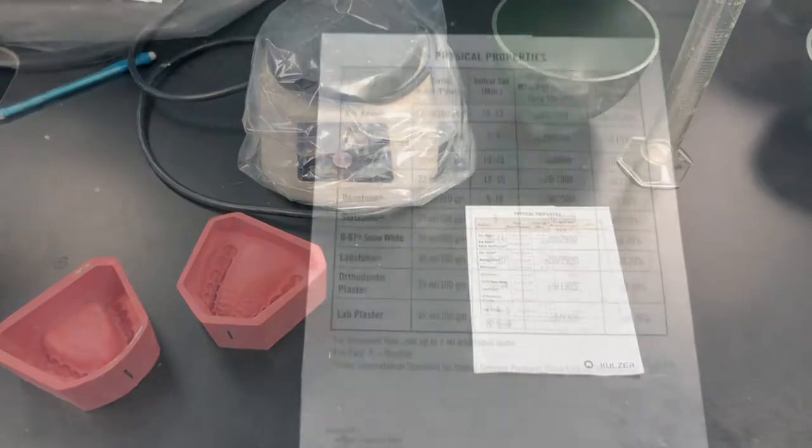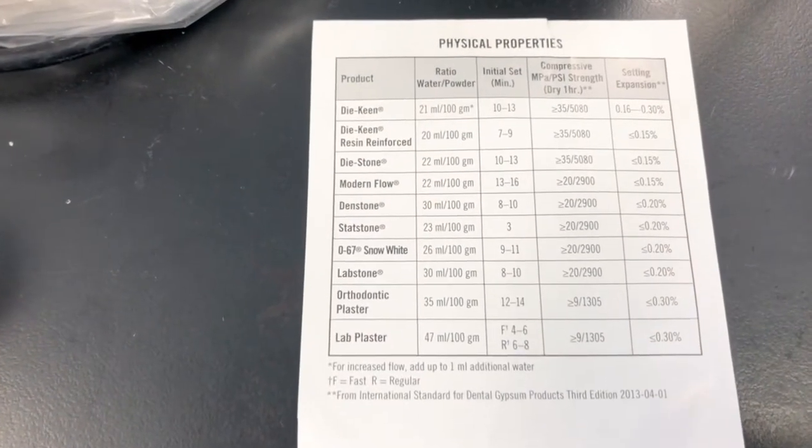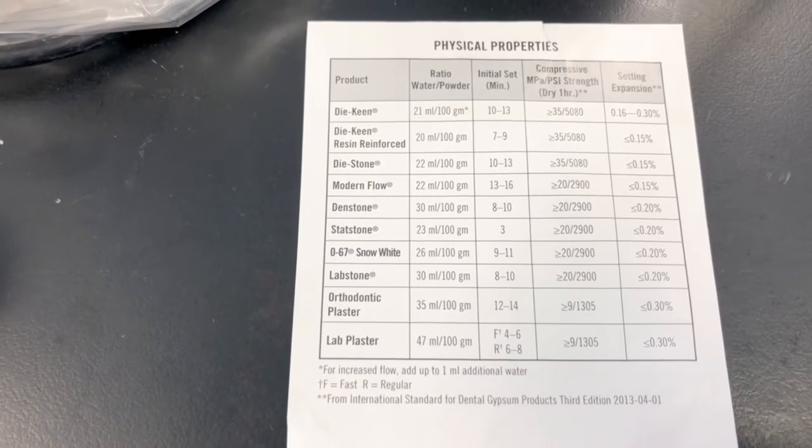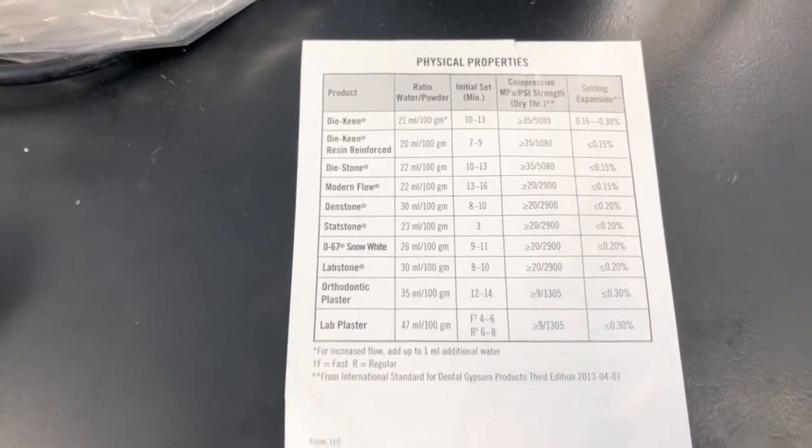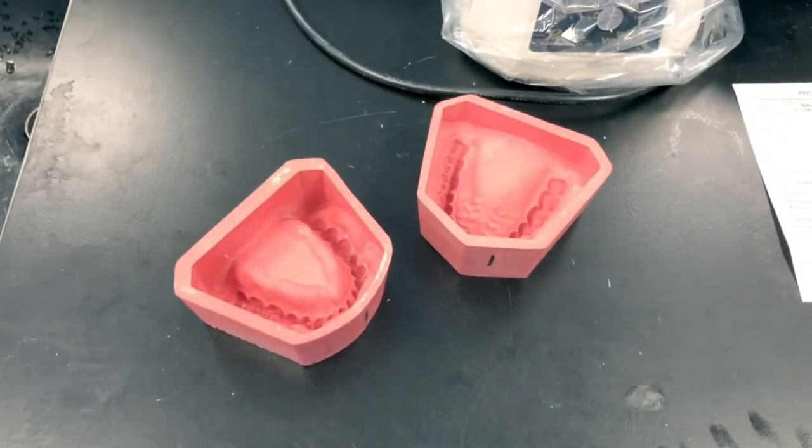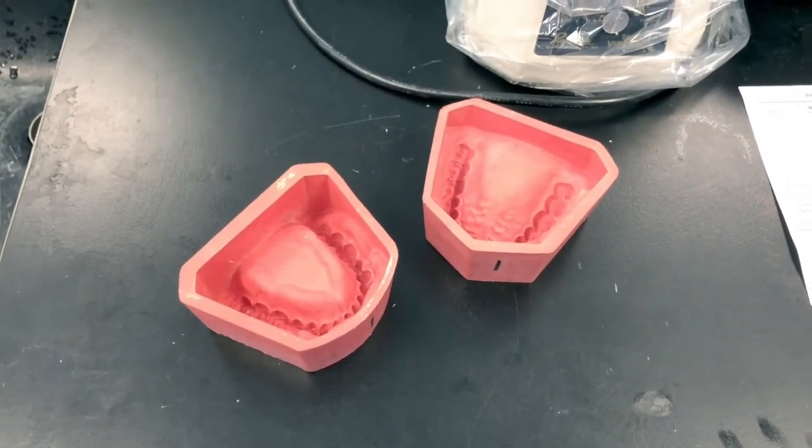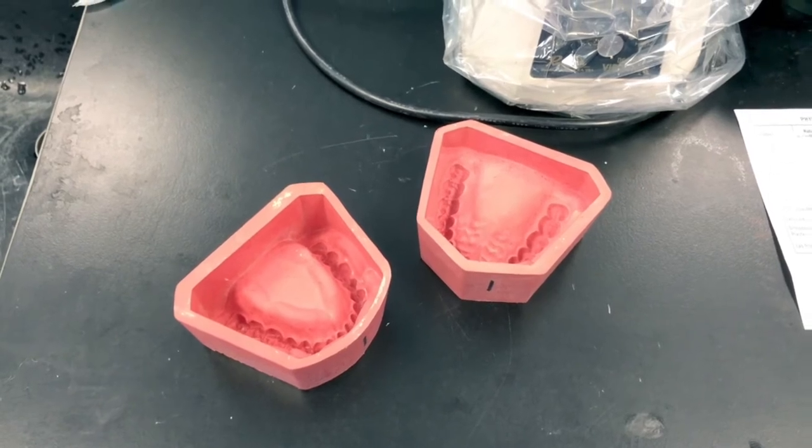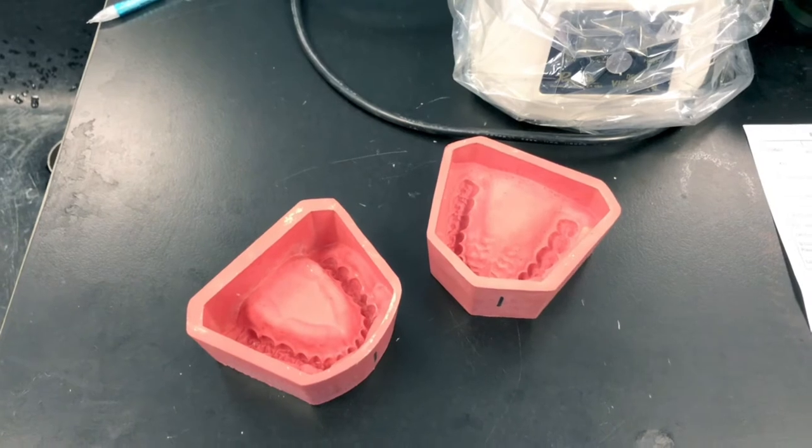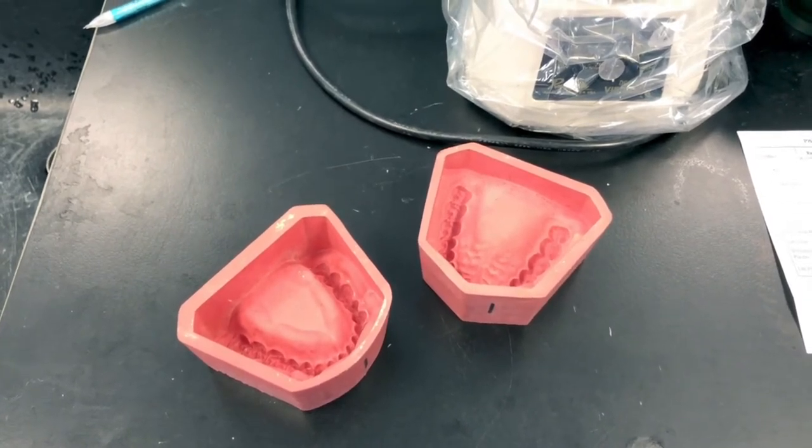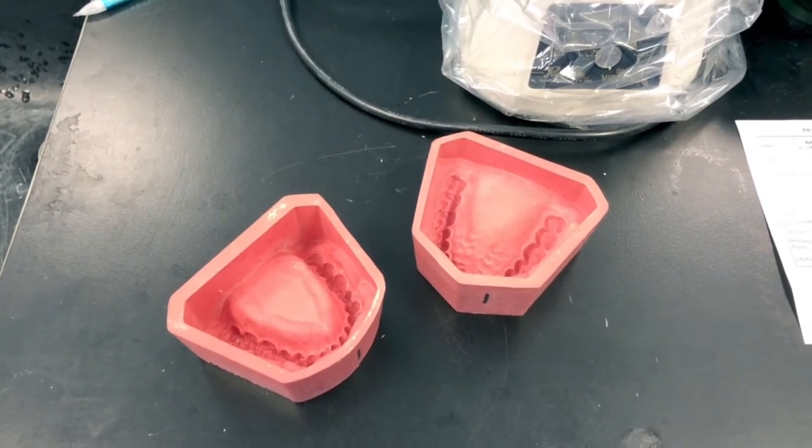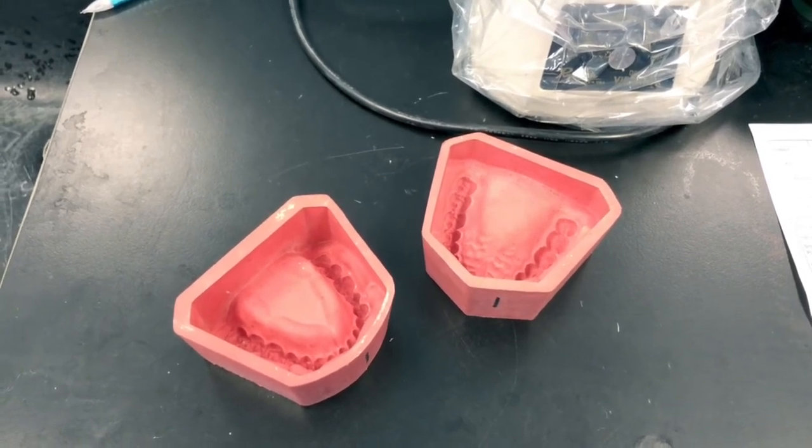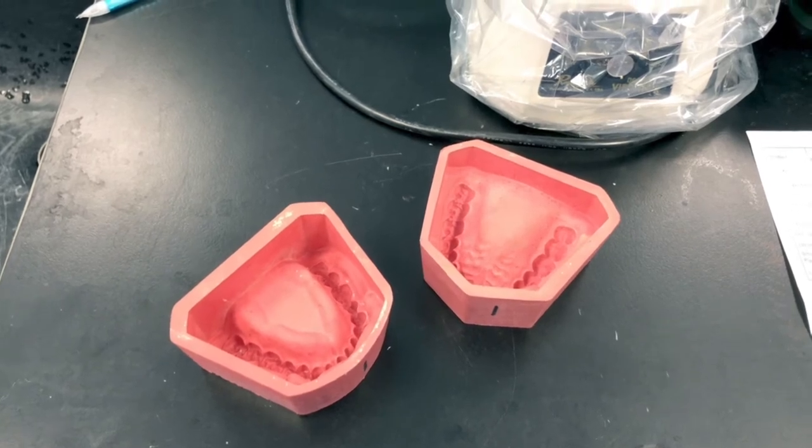Looking at our water to powder ratios and using dense stone, we need 30 milliliters of water for every 100 grams of powder. To fill up these rubber molds, I need 150 grams of powder for each mold. Pour up your impressions separately. Don't try to mix a huge batch of stone. Trying to pour up two full models with one batch is not a good idea because the stone will probably set up too quickly, especially if we're new to this technique. So 150 grams of powder means I need one and a half times the liquid, so I'll need 45 milliliters of water.